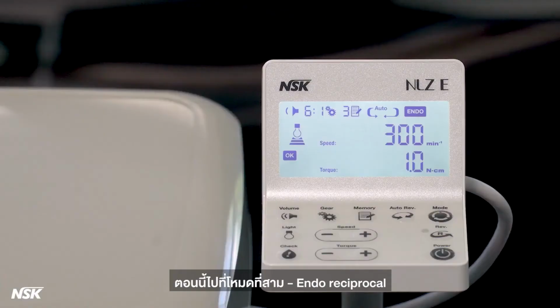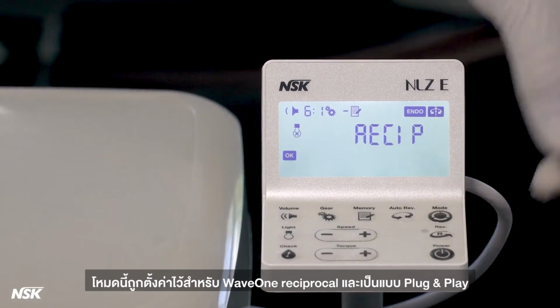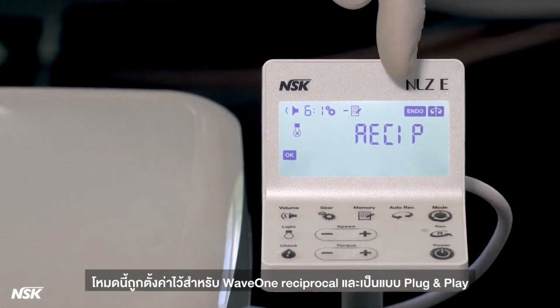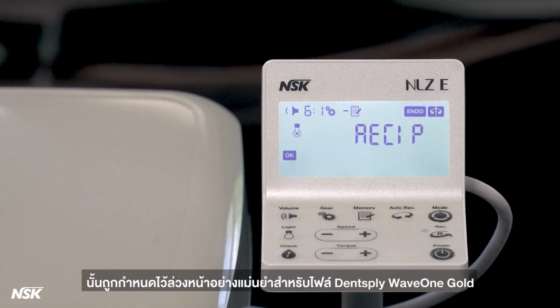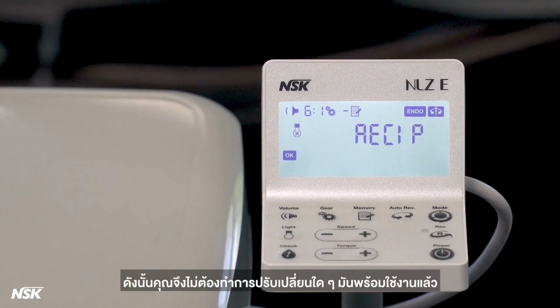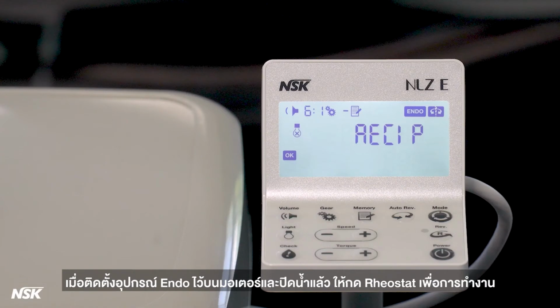Let's now move on to the third mode, Endo Reciprocal. This mode is set for WaveOne reciprocal and is plug and play. That means the speed and the shape of the unequal reciprocal movement is precisely preset for Dentsply WaveOne Gold files, so you don't need to make any adjustments. It's ready to go. All you have to do is pick this mode. With the Endo attachment mounted on the motor and the water turned off, press the rheostat for operation.